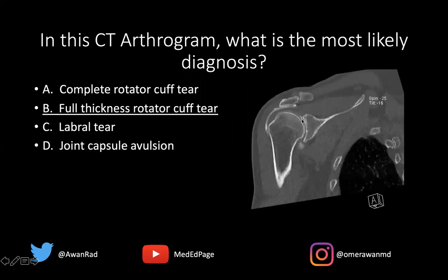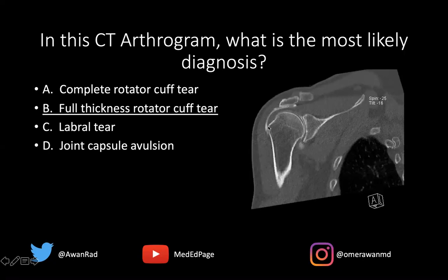If we take a look here, in a CT arthrogram we have dense contrast distending the glenohumeral joint. The key to all arthrogram cases is to understand where contrast is and where contrast should not be. We also have contrast in the subacromial subdeltoid bursa — it's underneath the acromion, going past the greater tuberosity of the humerus. The glenohumeral joint capsule does not extend past the greater tuberosity, so if you see contrast going past it, you can be confident it's in the subacromial subdeltoid bursa.